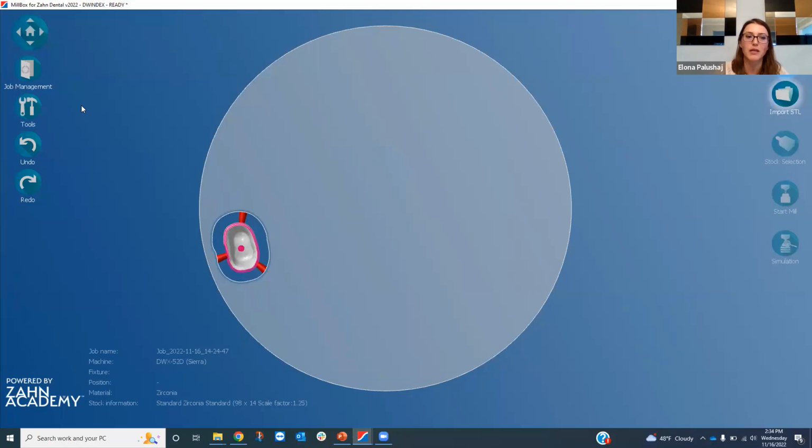All the software tests are done based on the latest software. So if you're upgrading your CAD, you might run into issues with your CAM, and it's best not to wait until that happens to work on your update.